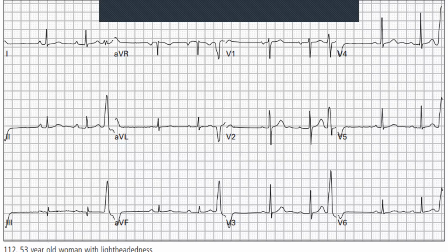If you were sitting at home and somebody phoned you and said, please come, we've got a 53-year-old lady with lightheadedness, what would your mind be thinking of as you're coming towards the emergency department? You'll be thinking about sugars, BPs, all the other vitals. Is the patient hypoxic? Does the patient have carotid illness, cardiac illness, things like that? Cardiac illness would come into it. You would think, okay, maybe there's something cardiac. So eventually it might lead you to doing an ECG. So you do the ECG and this is what comes up.